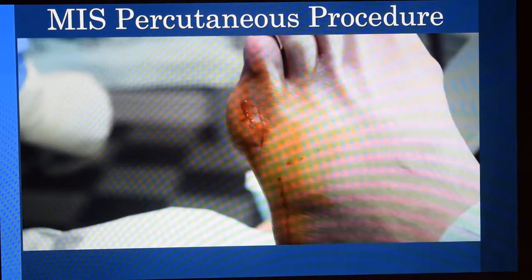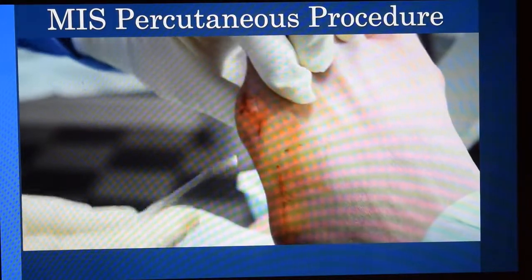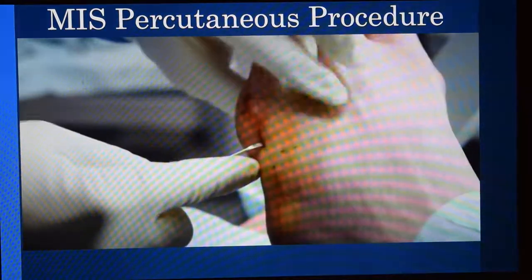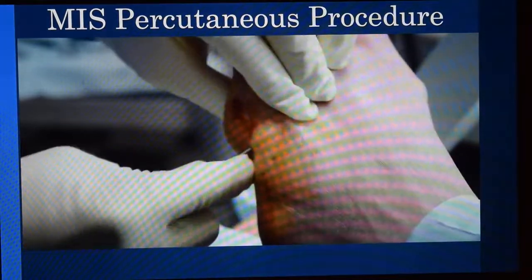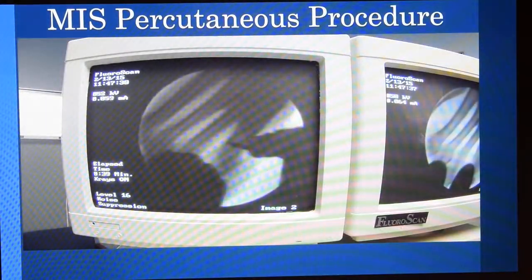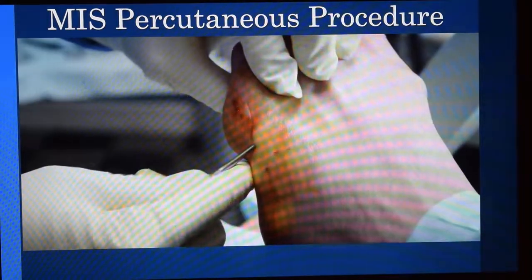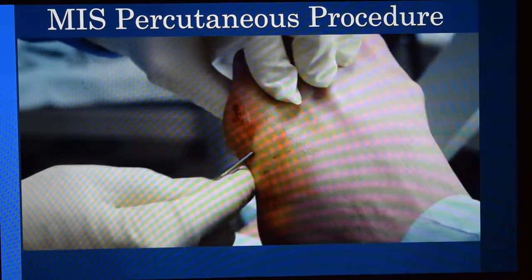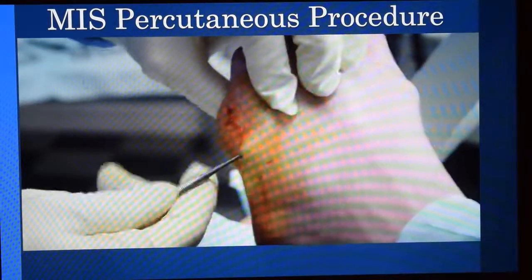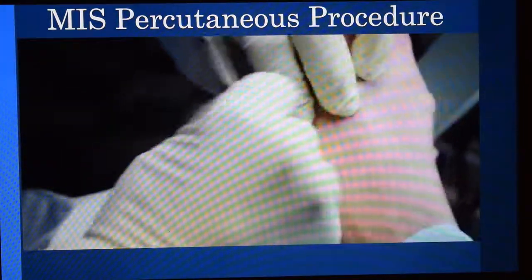Next, once the incision is made, the soft tissue is then undermined with a small rasp. This is to create a channel for your burr, as well as to remove soft tissue so it's not injured with the burr. Normally, I free both the plantar, lateral and dorsal aspects of the soft tissue, so you have free movement with the burr both on the plantar and dorsal surfaces here.